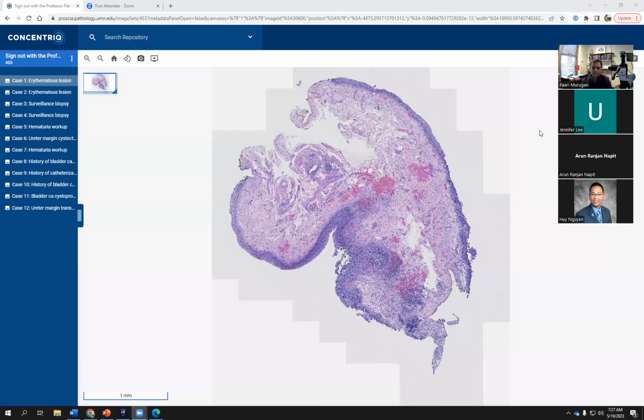You might think, okay, I have a non-invasive papillary urothelial carcinoma, high-grade non-invasive papillary urothelial carcinoma, for example. Since it's non-invasive, why shouldn't I be using the term carcinoma in situ here? We do not use this term. Whenever it's papillary, we always have to use the word papillary.